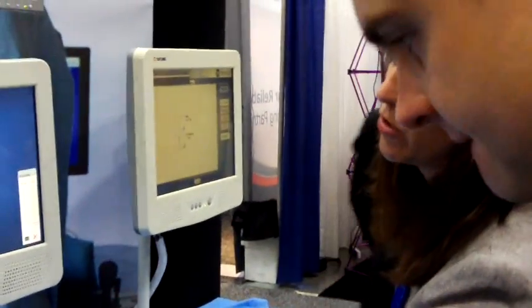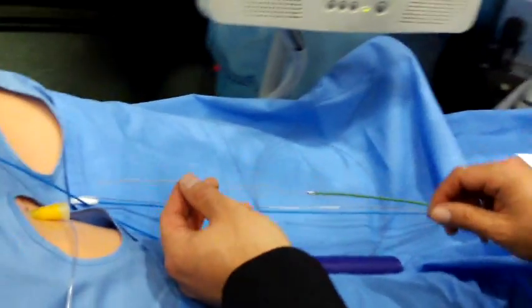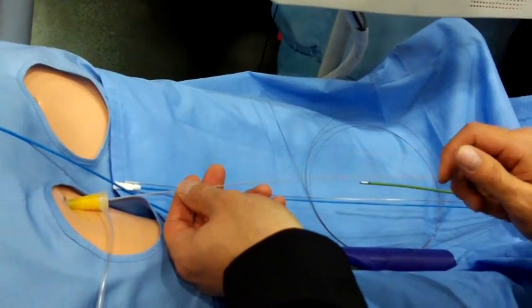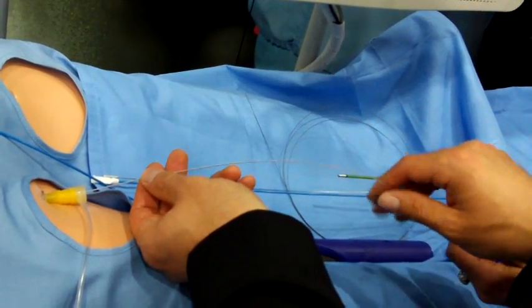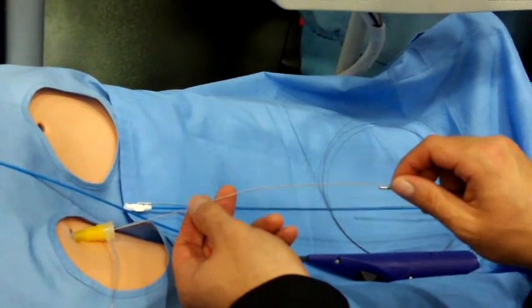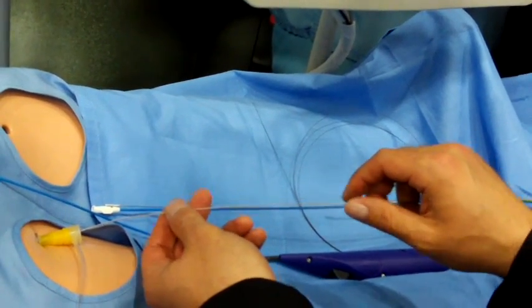I'm going to step on the floor, so what you're going to do here, I'm going to have you take this wire and put it into here. You're going to feel the machine kind of grab a hold of it a little bit, just keep pushing when that happens. What machine? The simulator. So you'll feel it. Is it the same feeling when you put it in a real patient? Well, not the grabbing.